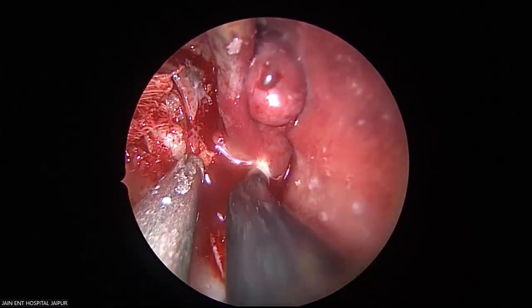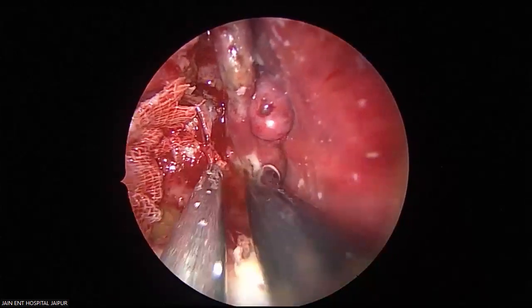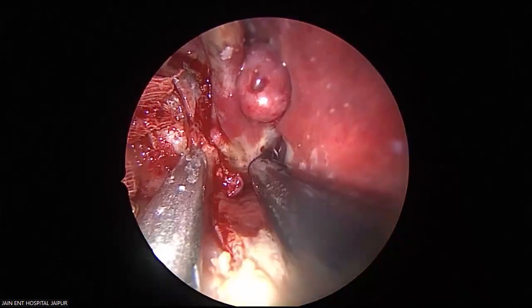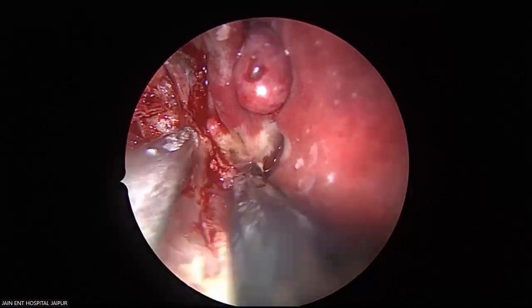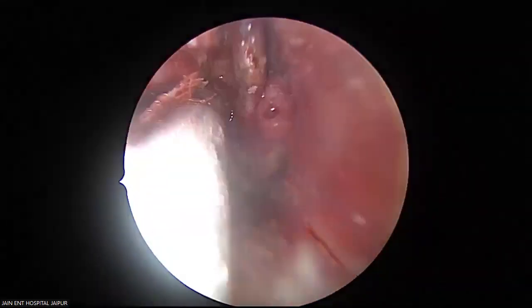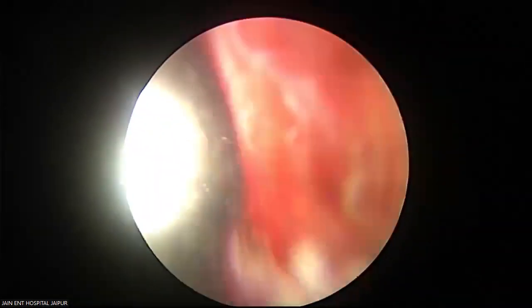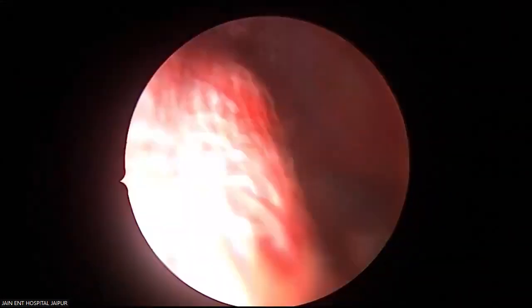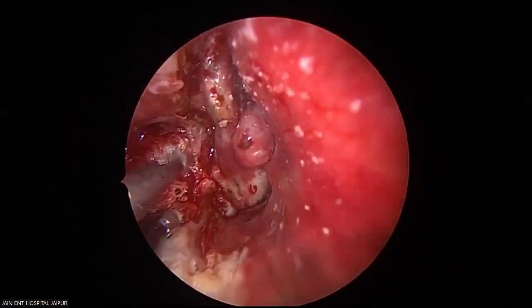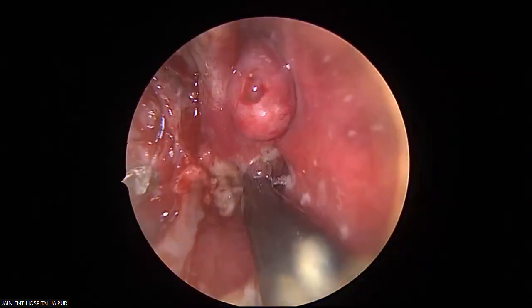More tumor surface is exposed, require more surface coagulation. This serves two purposes, not only to devascularize the surface and reduce the bleeding, at the same time allow the tumor to shrink. So far, we have seen hardly any bleeding. This is my more and more irrigation, which gives you a much clearer field. Irrigation is with normal saline or warm saline? Ringer or saline.